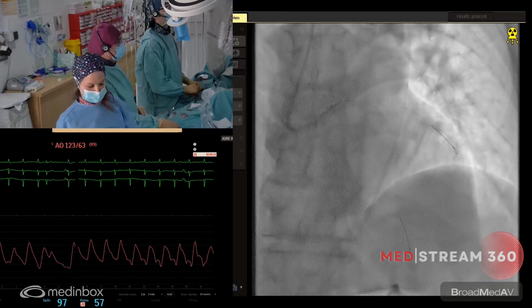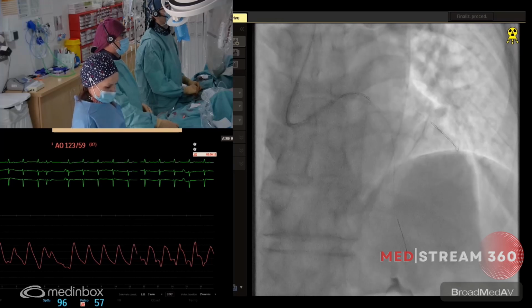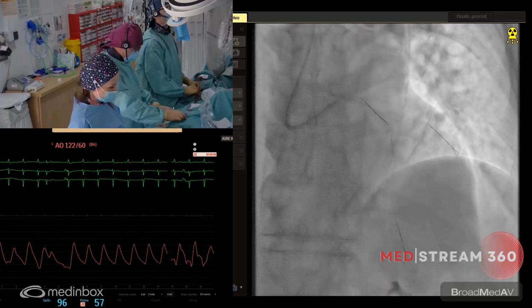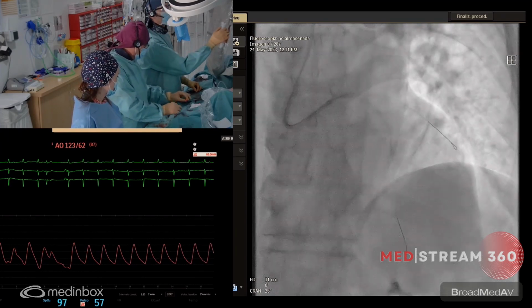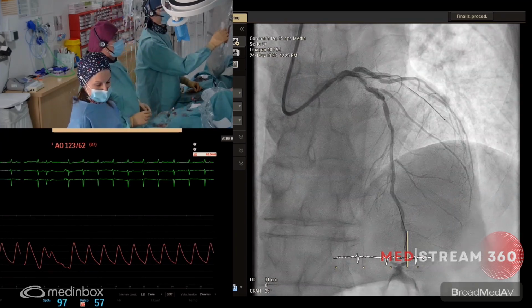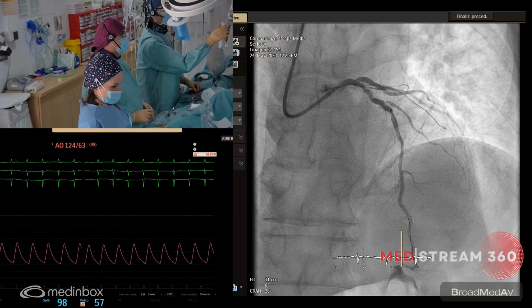Patrick, por favor, un test. ¿Cuál era el balón? Aquí, 6 atmospheres. No, eso es. So just here is a 2.0 balloon. Dale, 6. And you need to inflate it. The nominal pressure is 6. Okay, and just maintain 1 minute.